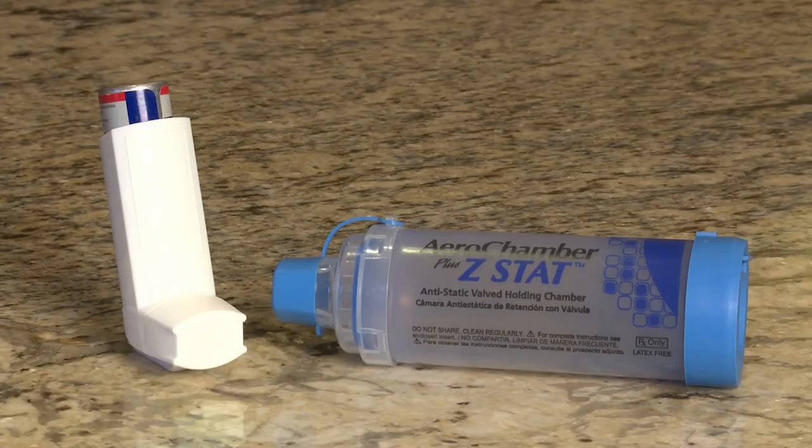Most MDIs should be used with a spacer. Combining the MDI with the spacer makes the medicine easier to use and work better. The MDI and the spacer are joined with the MDI adapter. The medicine is held in the spacer body and breathed in by the mouthpiece.